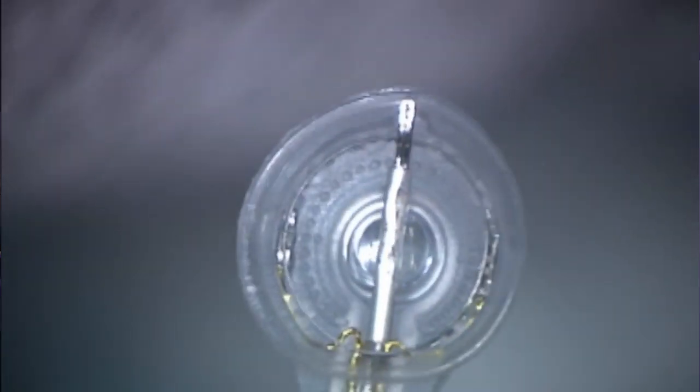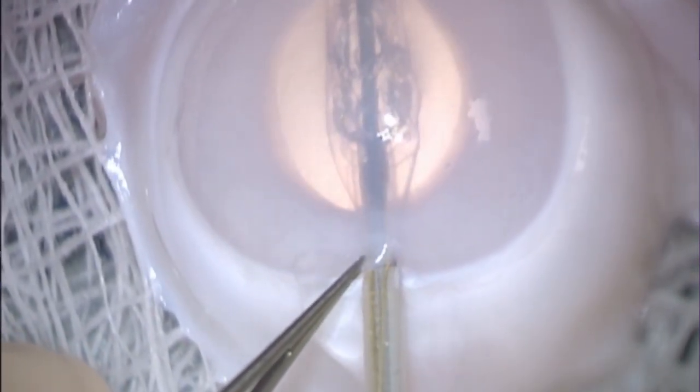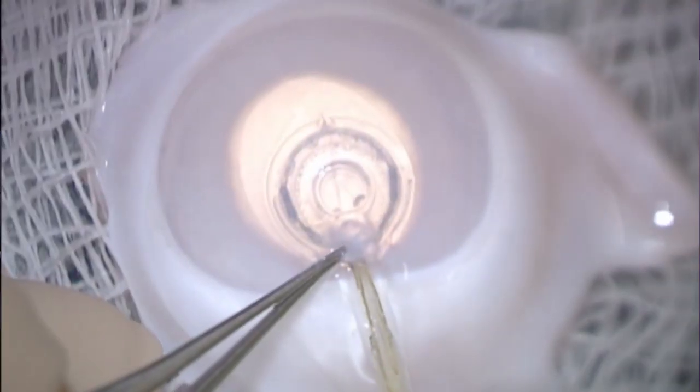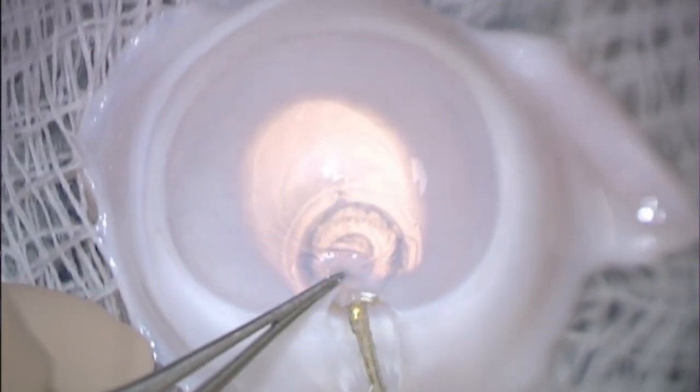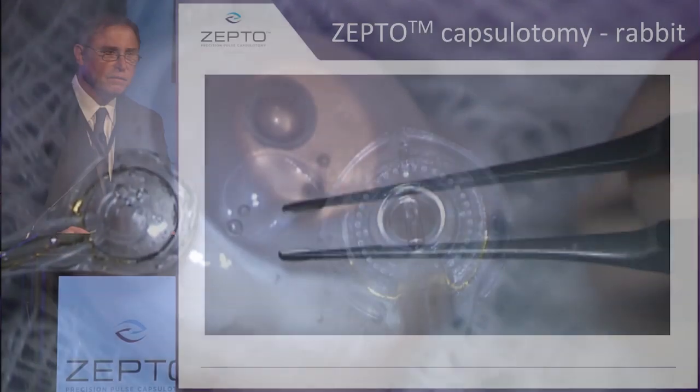Now this is the actual full device in surgery with Dr. David Chang. Here you see the device is elongated. The push rod is retracted. The device can now be aligned over the visual axis. It sucks down onto the capsule. Energy is delivered. And then the device folds back onto itself, and there you have the capsulotomy.